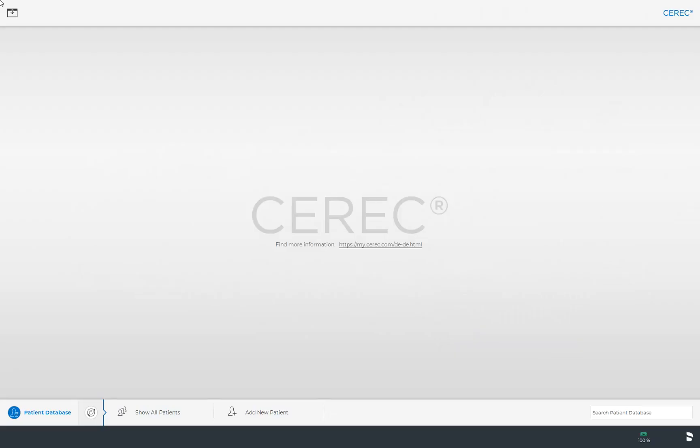You can open the system menu in every phase of the CEREC software. Depending on the phase that you are currently in, either all or only specific submenus will be displayed.